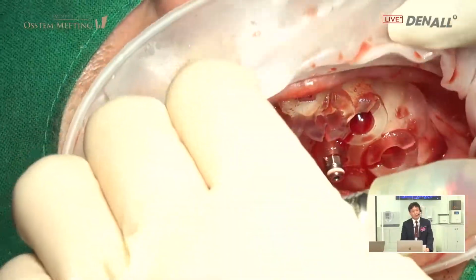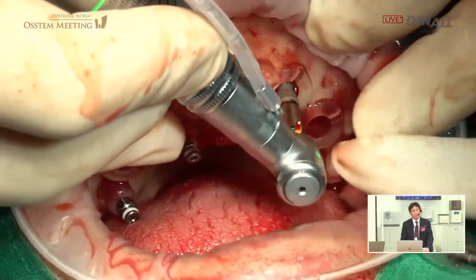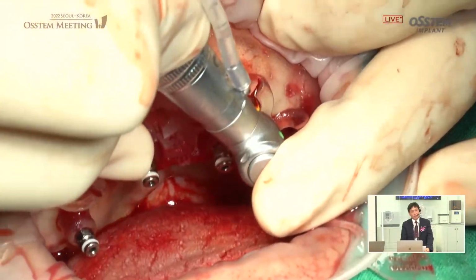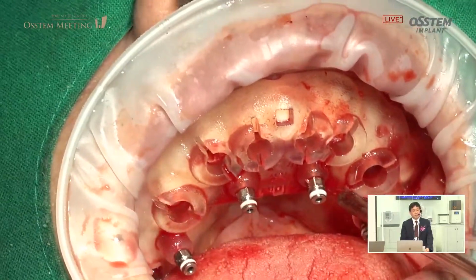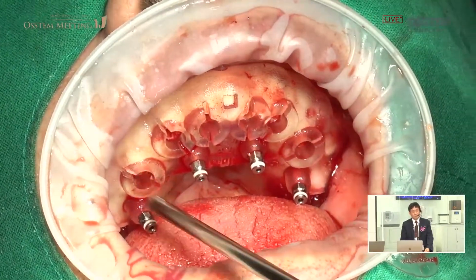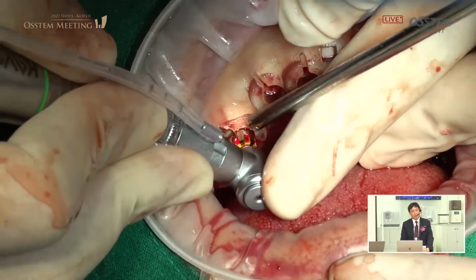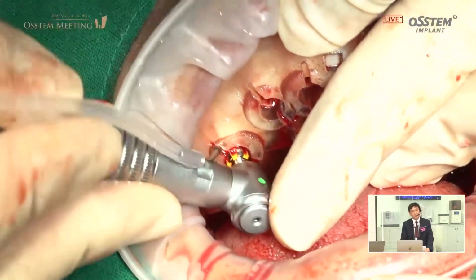So it's being placed with engine about 80%. In number 23, 4.5 by 8.5 implant is going to be placed. Number 5, 4.5 by 10 millimeter is prepared. In the posterior area, bone quality is not very good.